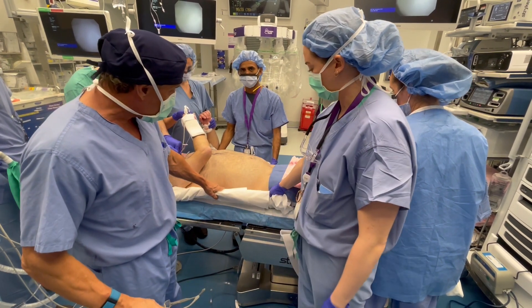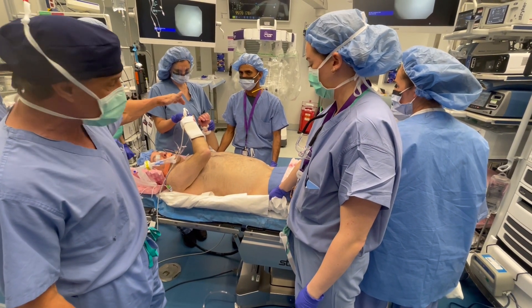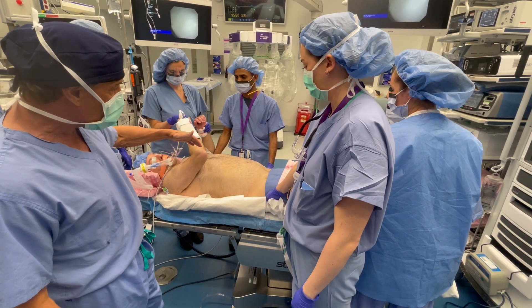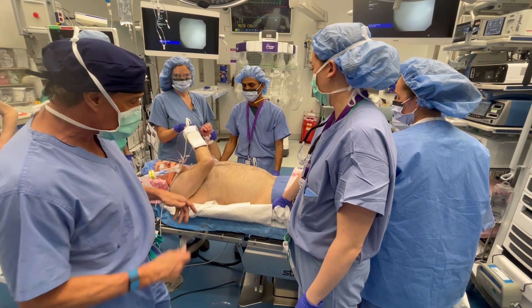First, there's a towel underneath for lifting. You have someone holding hands on the opposite side of what's going up. So this guy's having a right upper lobe segment, an S1 and an S6, so his right chest is up, left lateral.